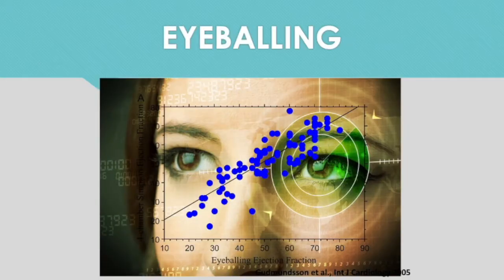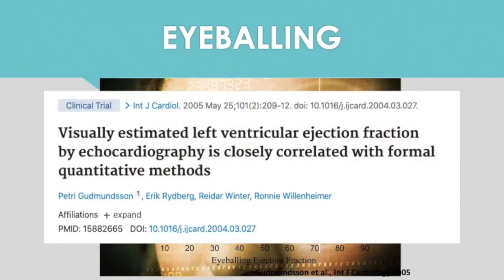Why eyeballing? Is eyeballing enough to help us in managing patients? There was a study in 2005. They compared eyeballing ejection fraction with formal quantitative methods among 89 patients. They found out all formal methods correlate significantly with eyeballing ejection fraction. So, don't feel inferior if you are not doing the measurement, as eyeballing is good enough to help us in managing patients.